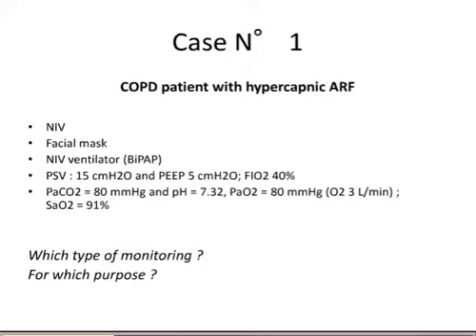Expiratory volume, right. If the patient is on the mask and we are discussing ventilator monitoring, then expiratory tidal volume is essential, at least. A very important point you mentioned is to monitor the tidal volume. It is very important to check the improvement in terms of gas exchange. If the tidal volume increases, probably the PCO2 will decrease. Otherwise, if the tidal volume doesn't change, there is no chance that PCO2 decreases. So it's a very important point.